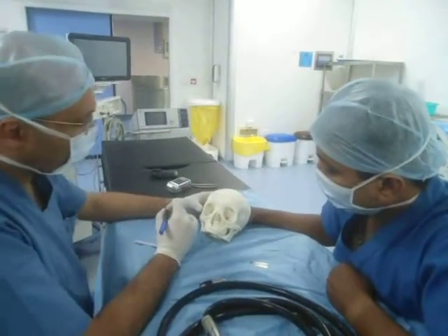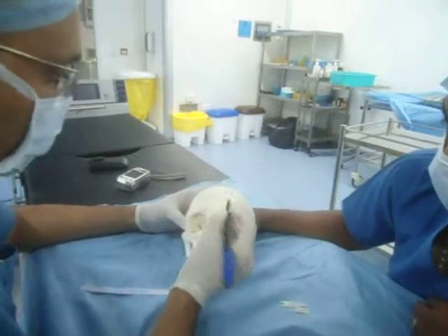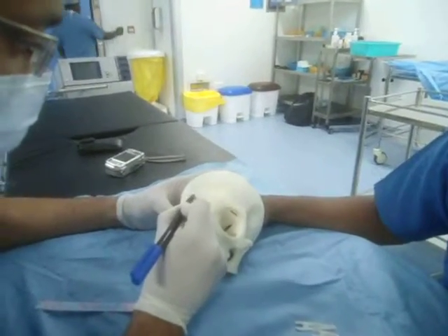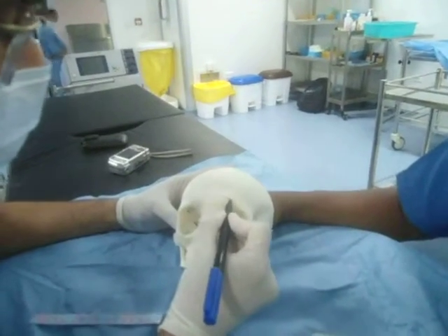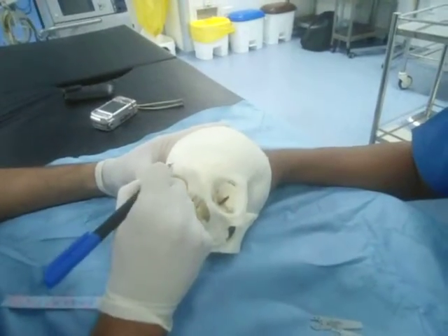So the first step in the correction is to mark the bifrontal craniotomy, where along with the neurosurgeon we raise the bifrontal craniotomy.